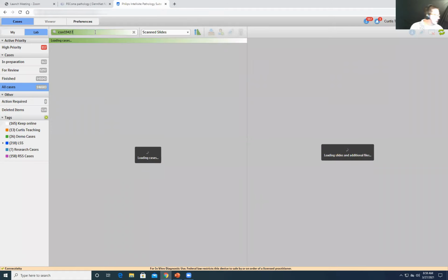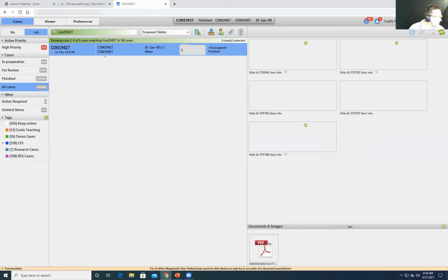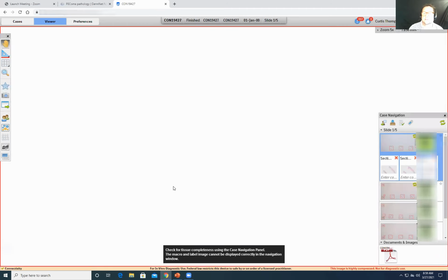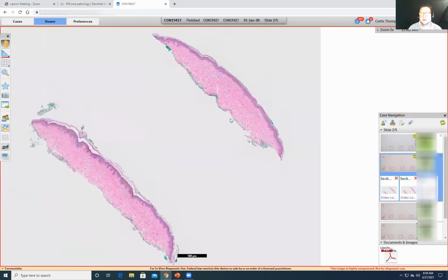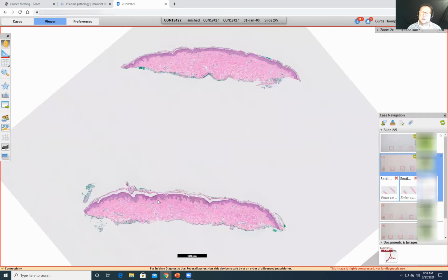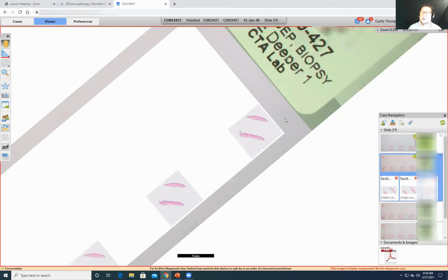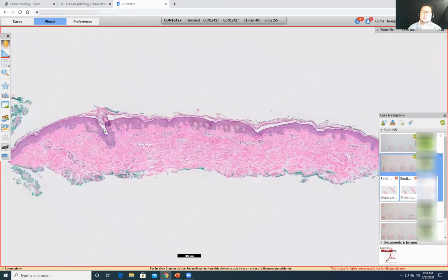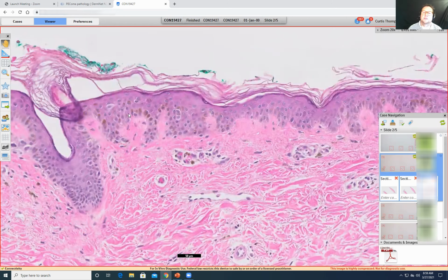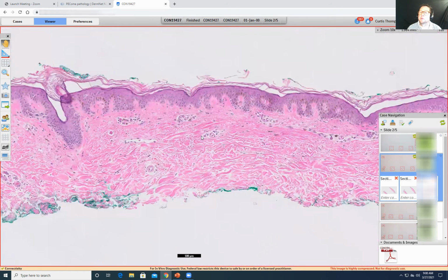This is a 40-year-old female, 3 millimeter C-shaped pigmented macule on the left tricep. This slide's going to be better. You can see here a shave biopsy, a tiny bit dome shape, not much going on. Here's another section. Maybe in the middle of the rete, you're a little bit elongated, and you can start seeing the pigment in the epithelium here, and also melanophages here.